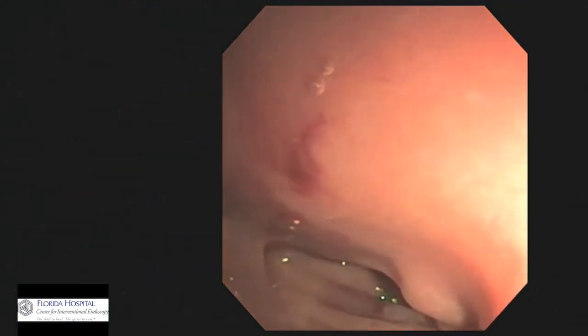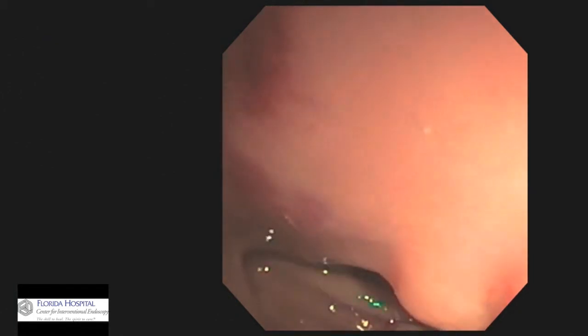A patient presented with a submucosal duodenal mass involving the ampulla. A radial EUS was performed.